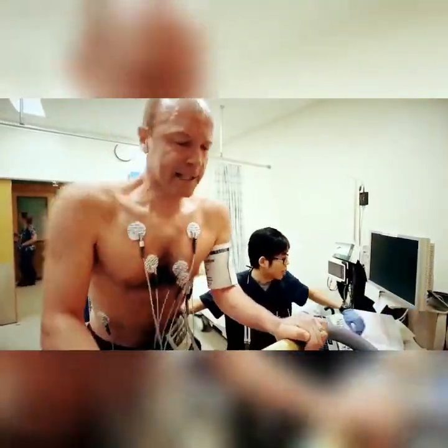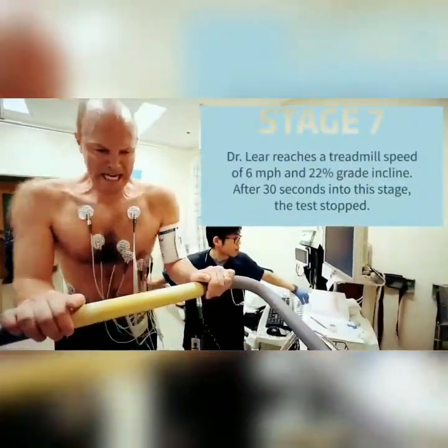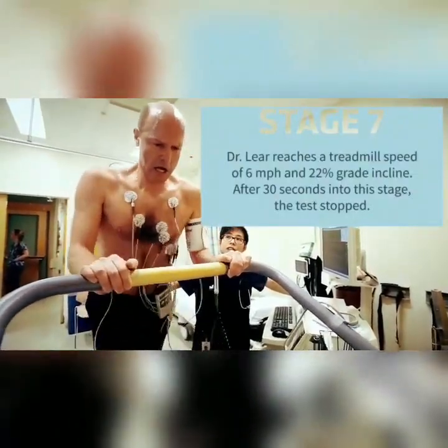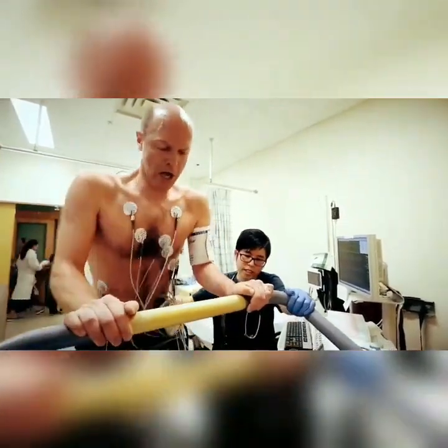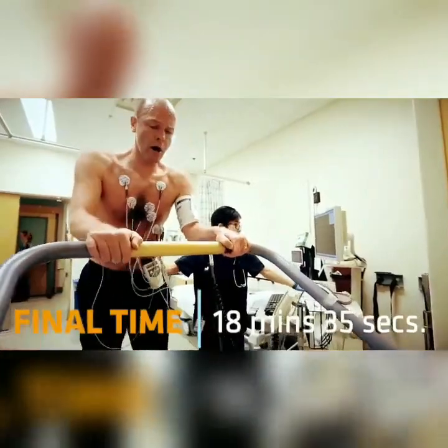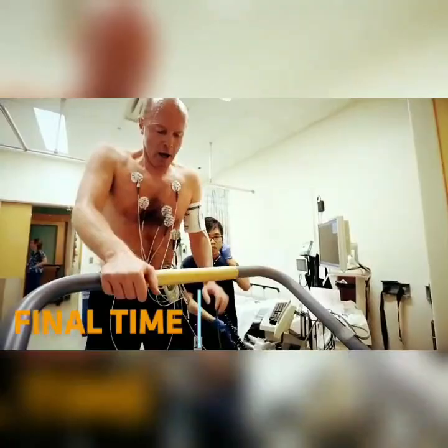Boom. Another 10 seconds. Another 10 seconds, okay. Work, keep it up. Okay, let's stop now. Alright, here we go. Keep walking until it comes to a stop, okay? Good work, sir, good work. Stay on the treadmill. Okay, I'm going to get your blood pressure, okay? Drop your left arm down.